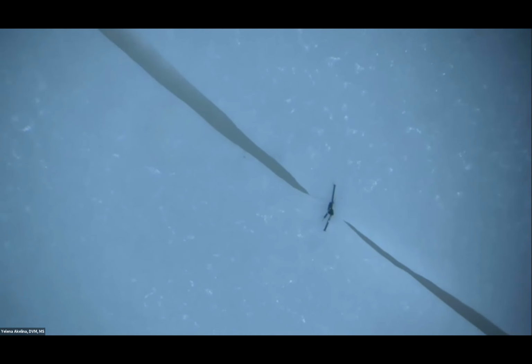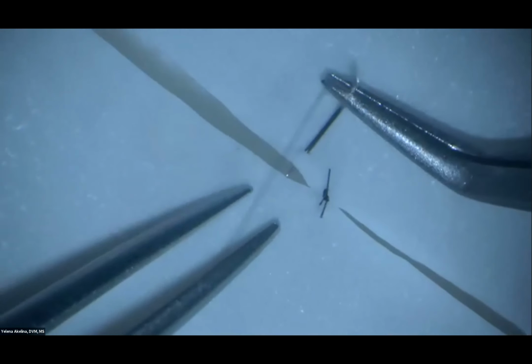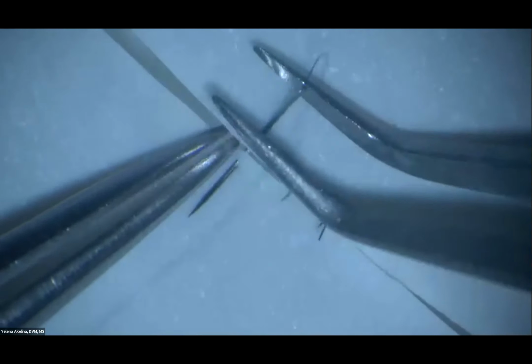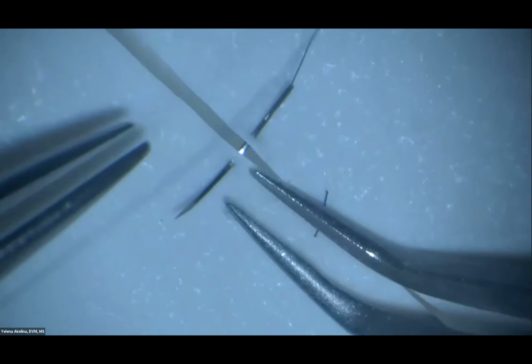I'm trying to arrange it so you can all see in the middle. This is at a much higher magnification. You take the bites, and when you're taking the needle out, you zoom out together so you can visualize more of the field.